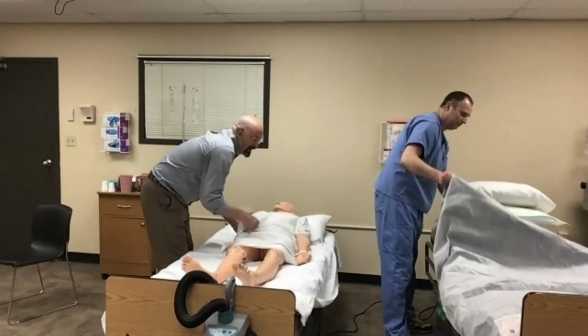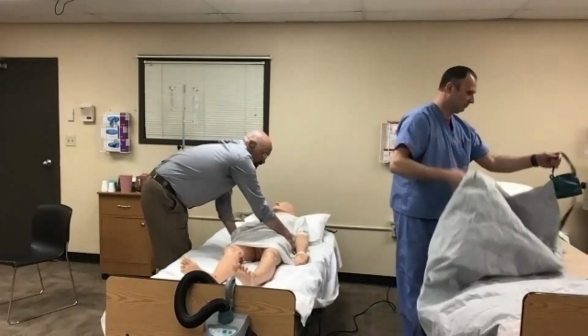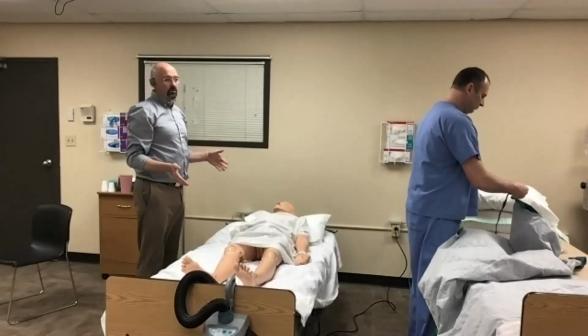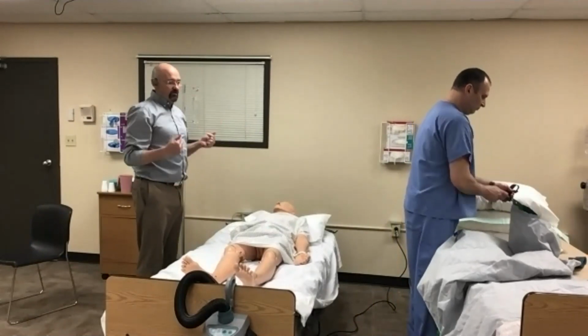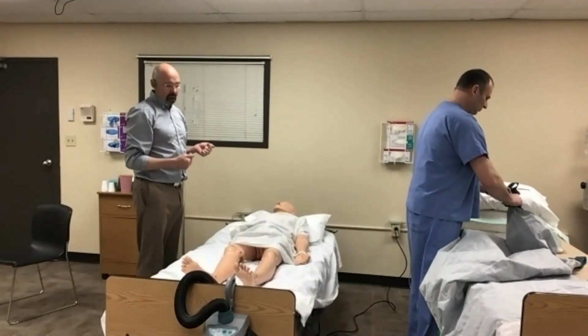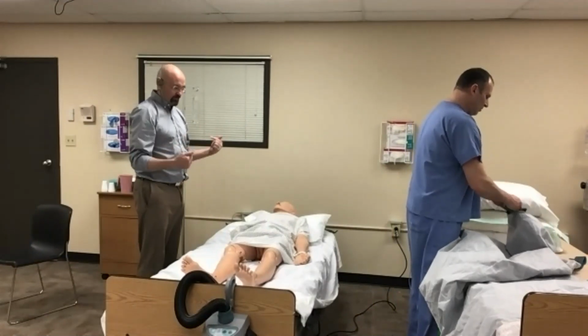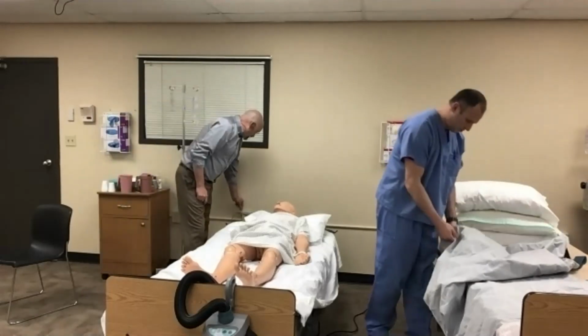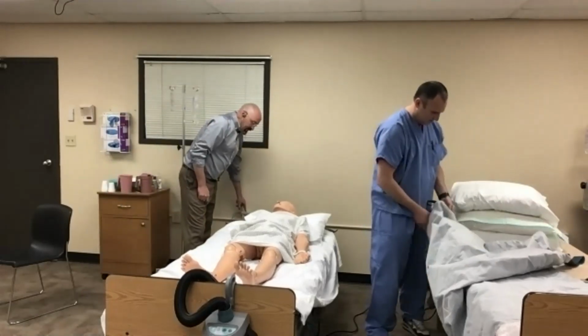If your patient is taking up more than three-quarters of the bed, you're going to have an extraordinarily difficult time proning them on the same surface, just because of their width and oftentimes their girth. You're not going to be able to do that.